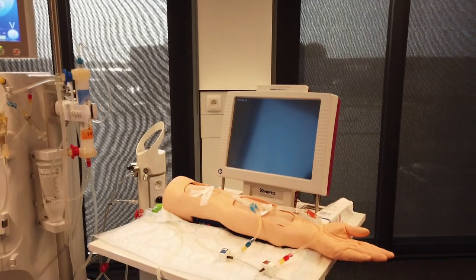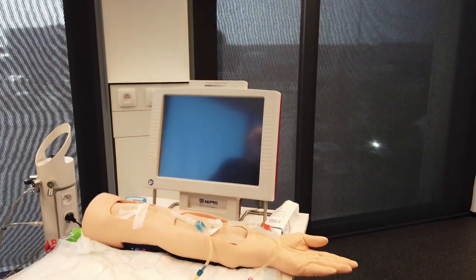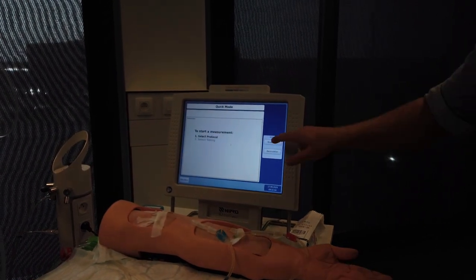Attach the sensors to the bloodlines as early as possible so they can warm up. To turn on the D-Mate Nephroflow, use the power button found on the right side. The device starts in quick mode and allows for quick access to the access flow and recirculation measurement.